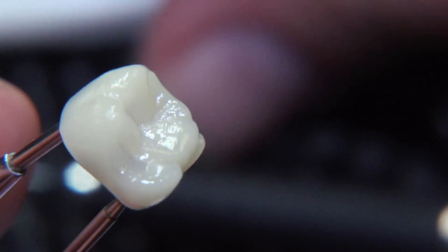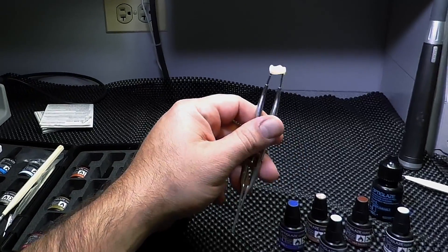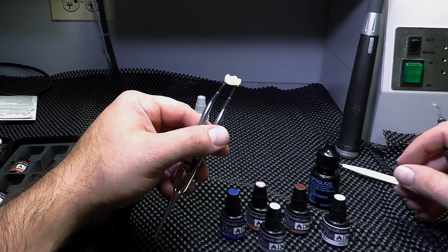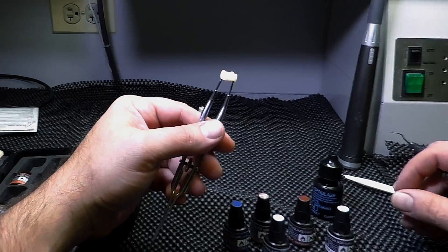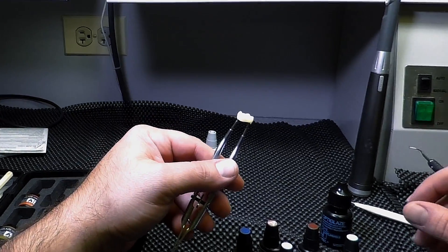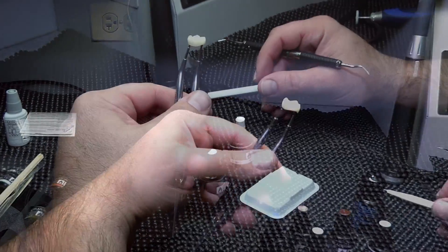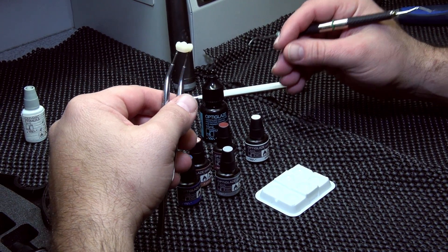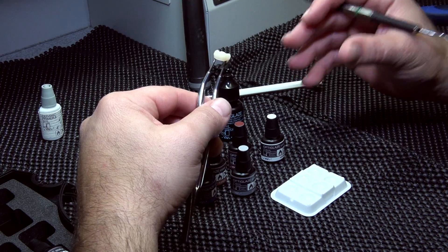Once that's done, let it air dry or use an air hose to manually dry it. There are many different shades and colors in the OptiGlaze color kit, meant to achieve subtle and different types of effects — from adding one color for warmth or occlusal stain, all the way to full characterization with different effects, decalcification, and craze lines.